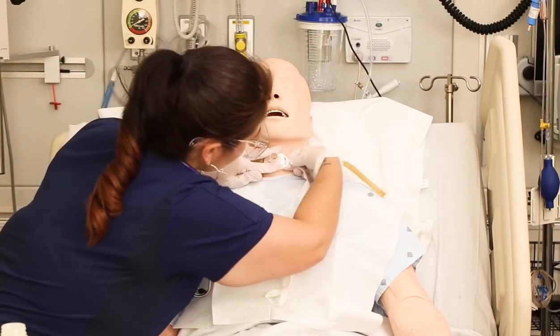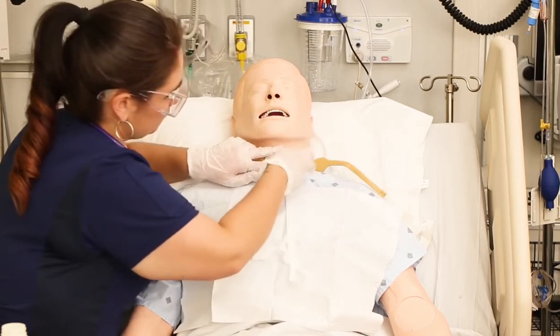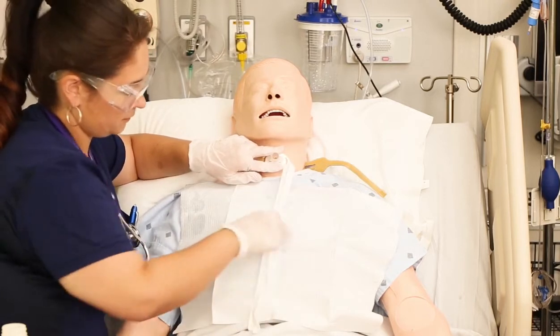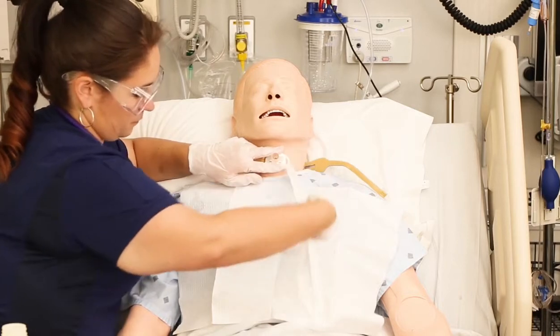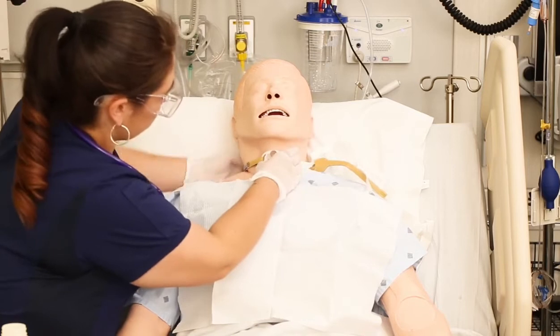Remember, you always keep one hand on the trach in case the patient coughs. That thing could fly right out. So once you insert the new ties on one side, you're going to slide both the new and the old ties behind the patient's head, still holding the trach with one hand.